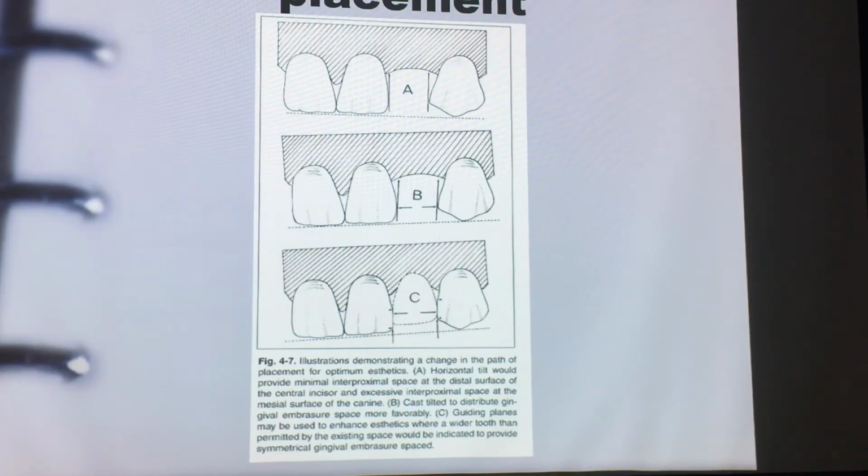And this is created by the survey table and how we block out these undercuts and try to maximize or minimize the undercuts for our liking. Now actually in this case, this is a very aesthetic consideration of the guide planes of distal of 2.1 and mesial of 2.3. We need to minimize those undercuts. We may even ask the dentist to prepare the proximal surfaces of those abutment teeth to minimize them.